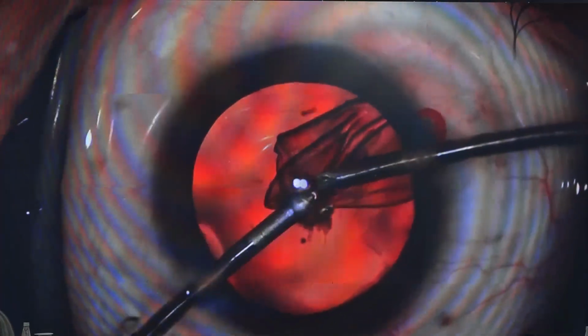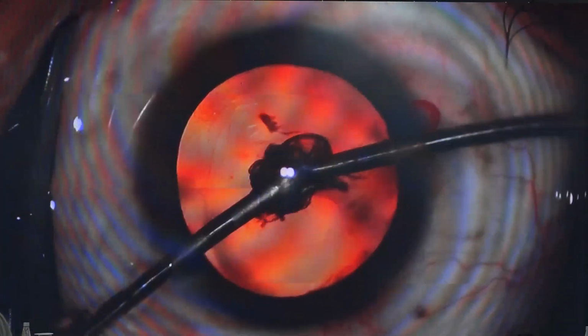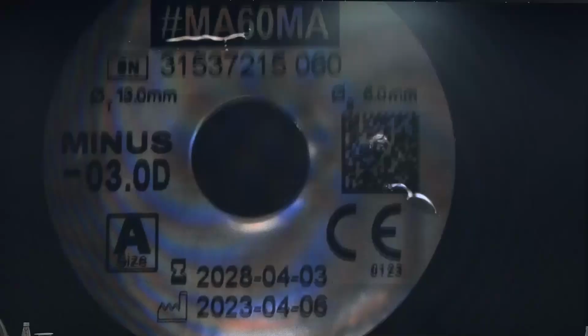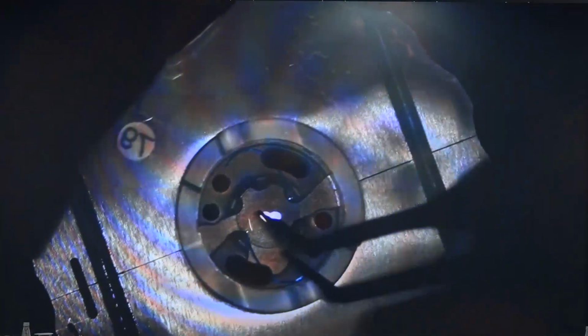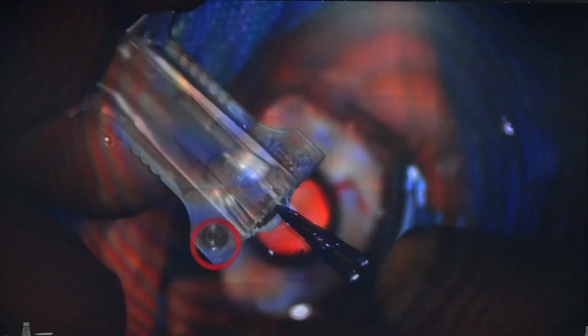Meticulous cortical cleanup is necessary, and each fiber needs to be removed because you have to reduce the incidence of PCO in such cases. Here, my preference is a multi-piece lens, and as I just said, the cartridge has to be specific. You can use a B cartridge, which is a larger one, but I prefer the C one, and my incision size is 2.8 millimeters.